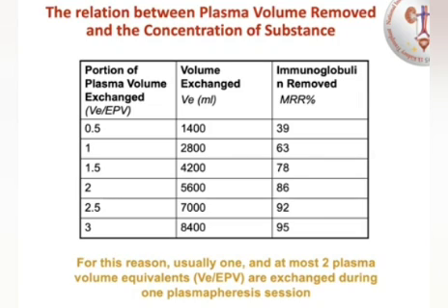As far as there is no indication, as we mentioned, there will be no point of filtering more plasma volume, because you will achieve almost the same clearance.